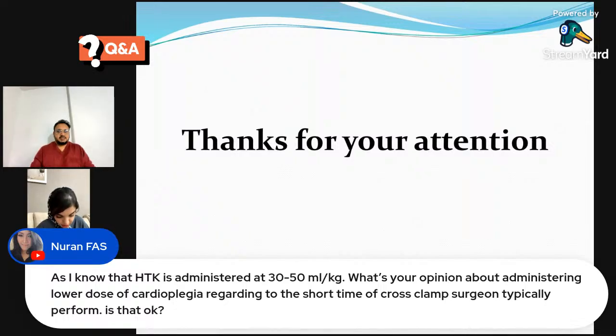Yeah, HTK has a long effect. So it's better to use Del Nido or St. Thomas for short procedures.